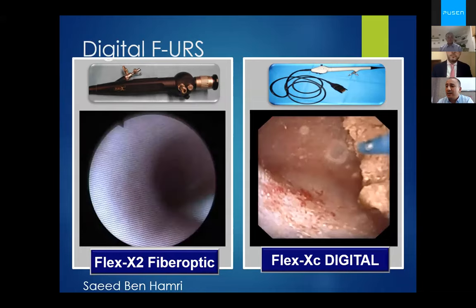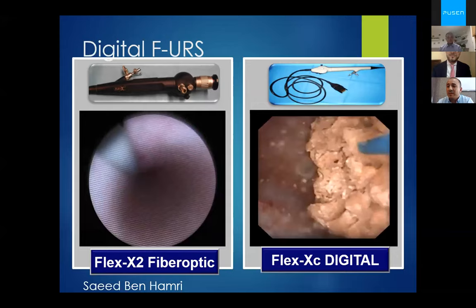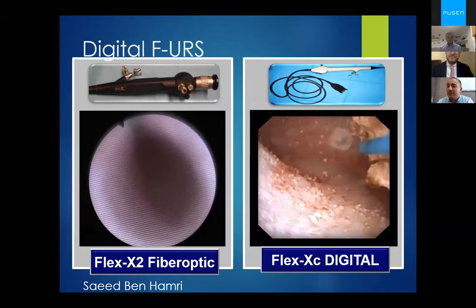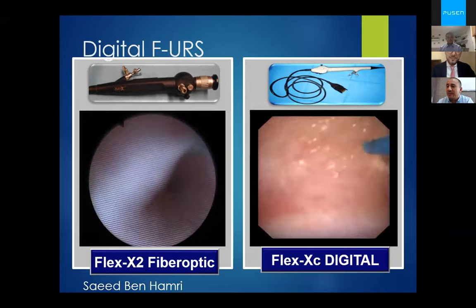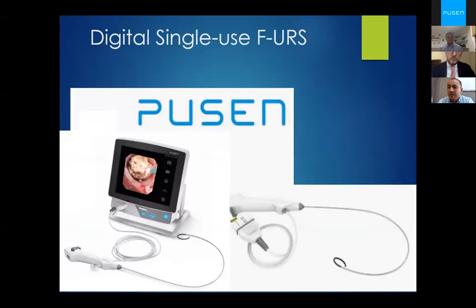However, the external diameter of those digital ureteroscopes has increased: 9 French at the distal end and 10.9 at the proximal end, due to the size of the sensors, currently 1 millimeter. Then, recently, came disposable or single-use scopes, like we see here, Pusen. There are other companies like Boston Scientific, and now many other companies have their own digital single-use scopes.